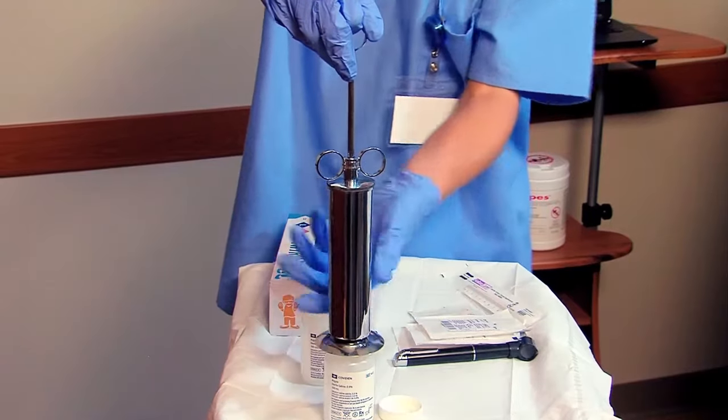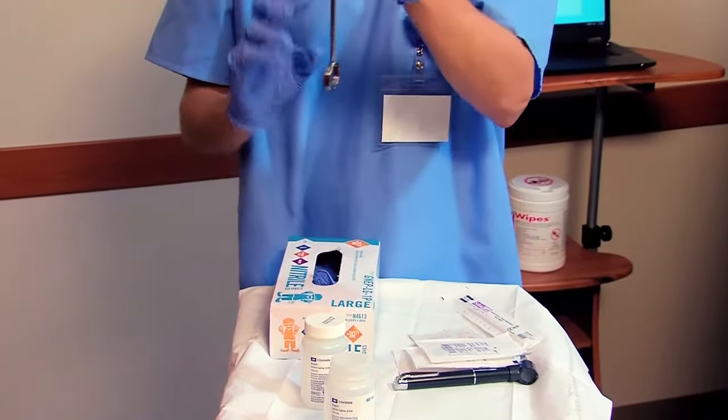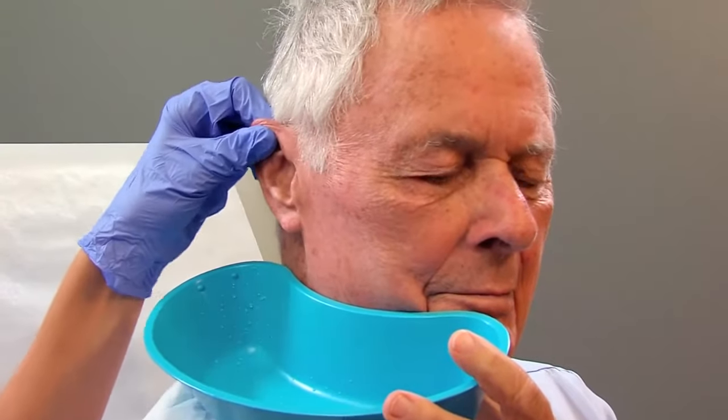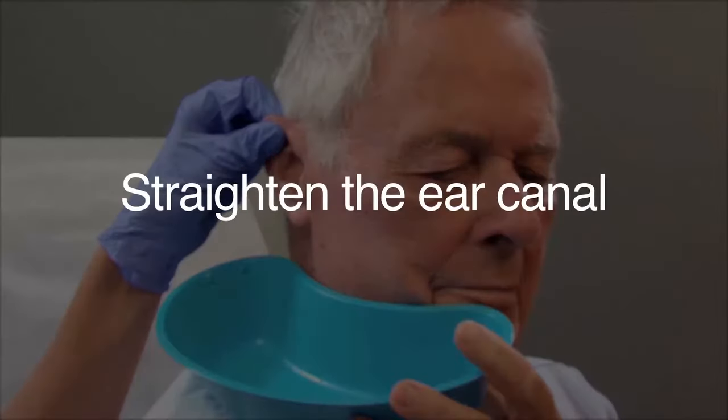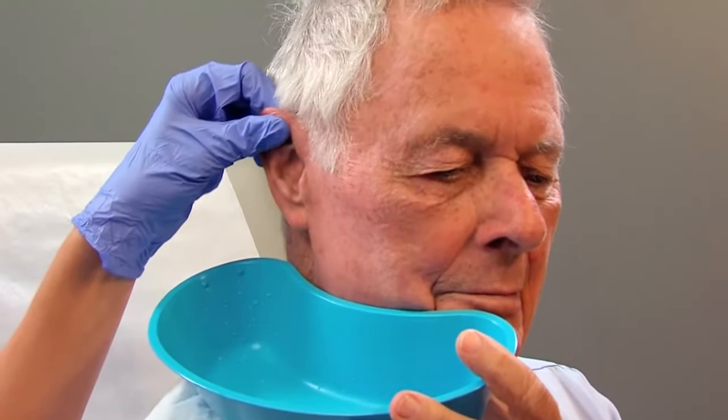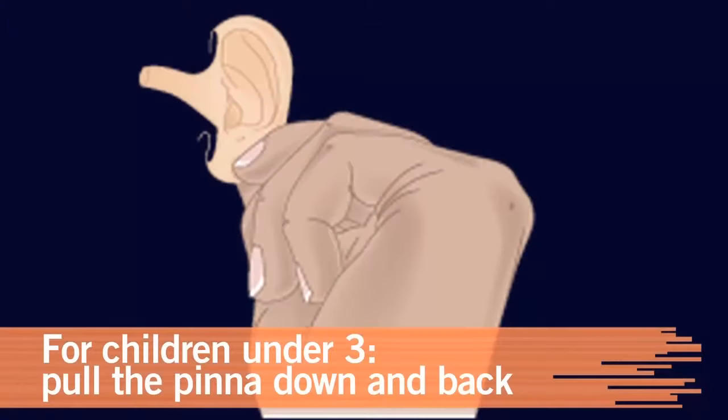Trapped air increases the pressure of the irrigation and may cause discomfort. To help the solution circulate, straighten the outer ear canal. For adults and children over three, gently pull the pinna up and back. For children under three, pull the earlobe down and back.